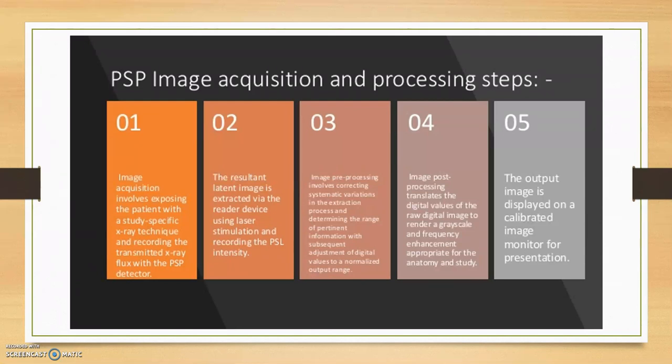And it's less efficient and irresponsible for an RT to not erase the cassette after each use. Put them to the side because if mistakenly seen as a fresh cassette, a new image cannot be stored on that occupied cassette, which is some more wasted exposure on the patient and it uses up time. And that also violates ALARA, which states that the patients must receive the lowest radiation dose achievable.